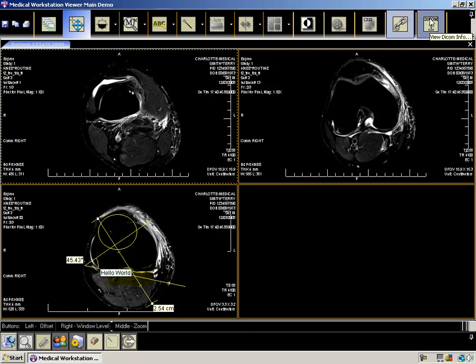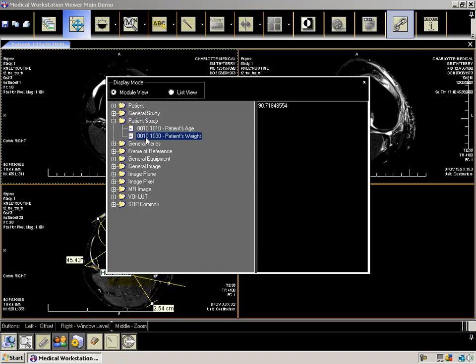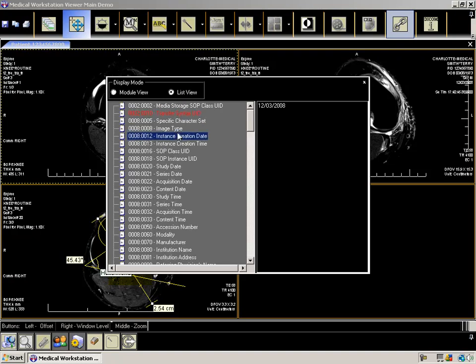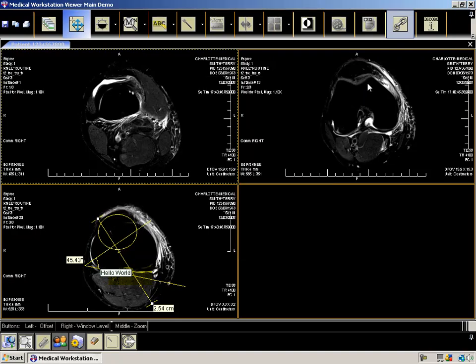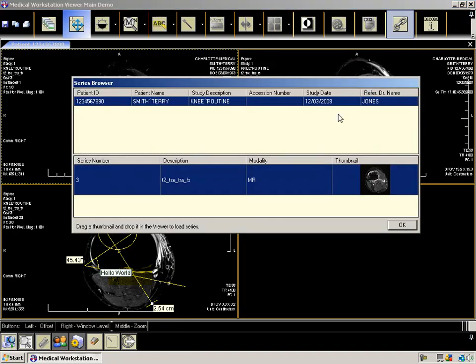To obtain more information about the dataset, use the DICOM button. You can view the DICOM file by module or in a list. We also have a series browser, which lets you quickly browse through all the series loaded in the viewer.